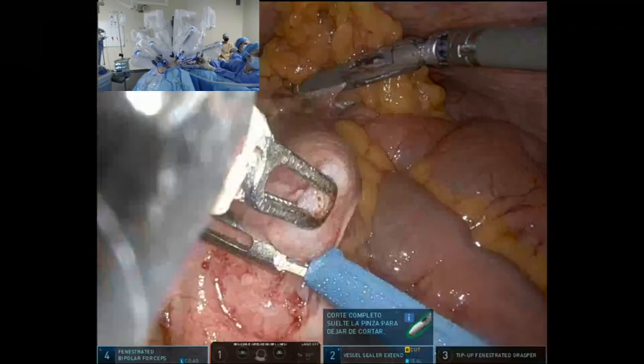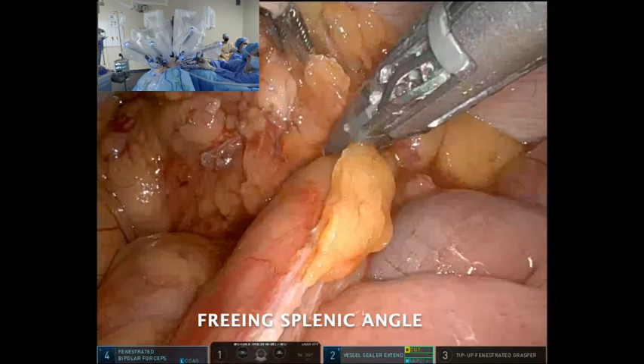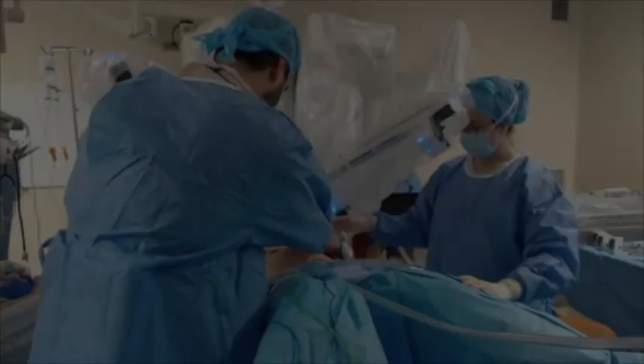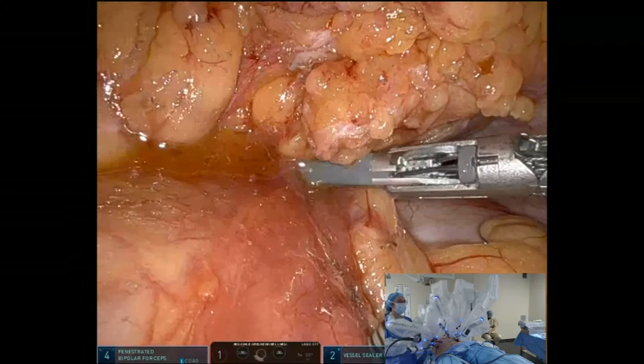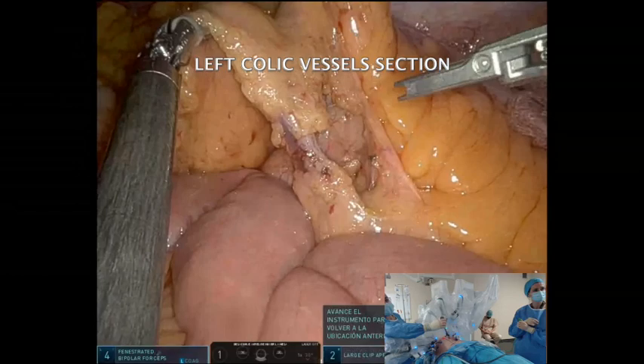Dissection continues towards the splenic flexure. Due to the patient's obesity, it becomes more complex, so the patient is tilted to the right, maintaining Trendelenburg. The left mesocolon is dissected over Toldt's fascia with ligation of the left colic and sigmoid vessels. The left parietocolic ligament is then dissected.